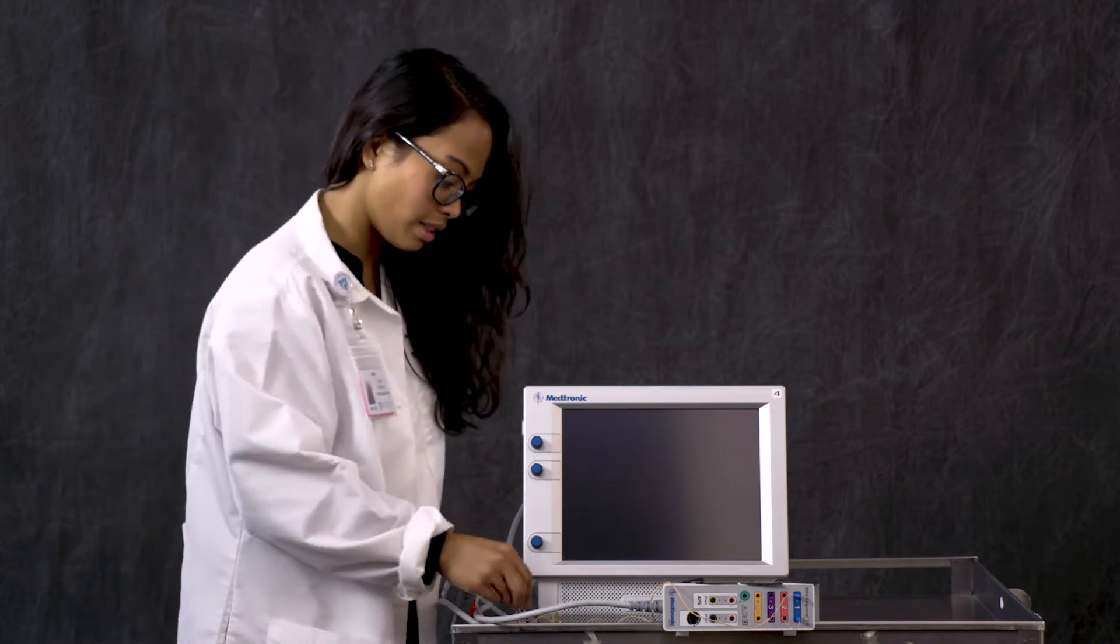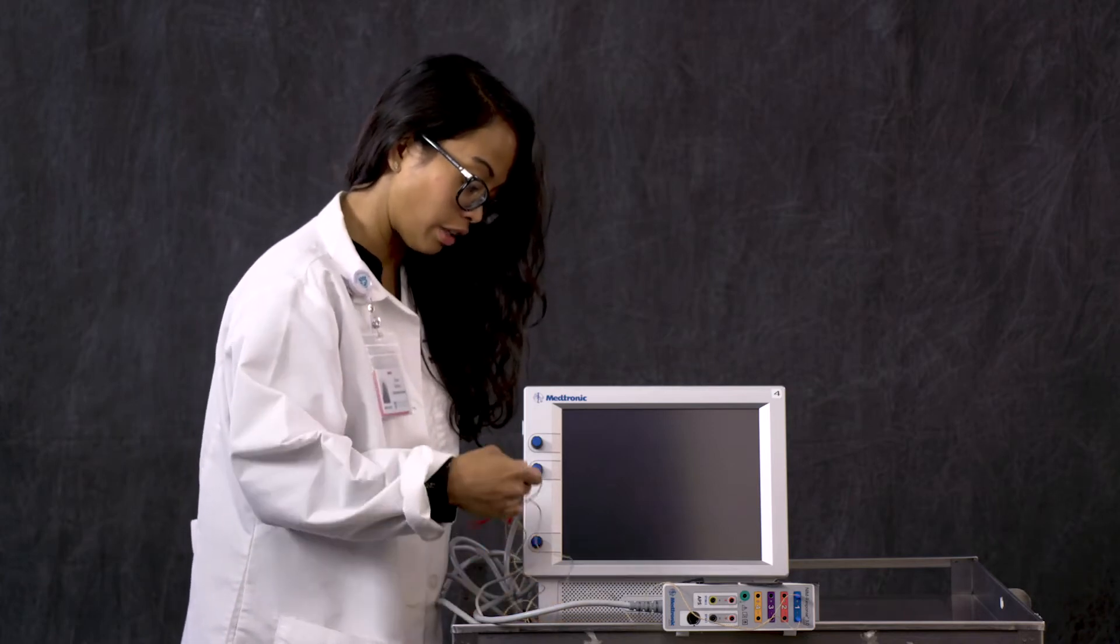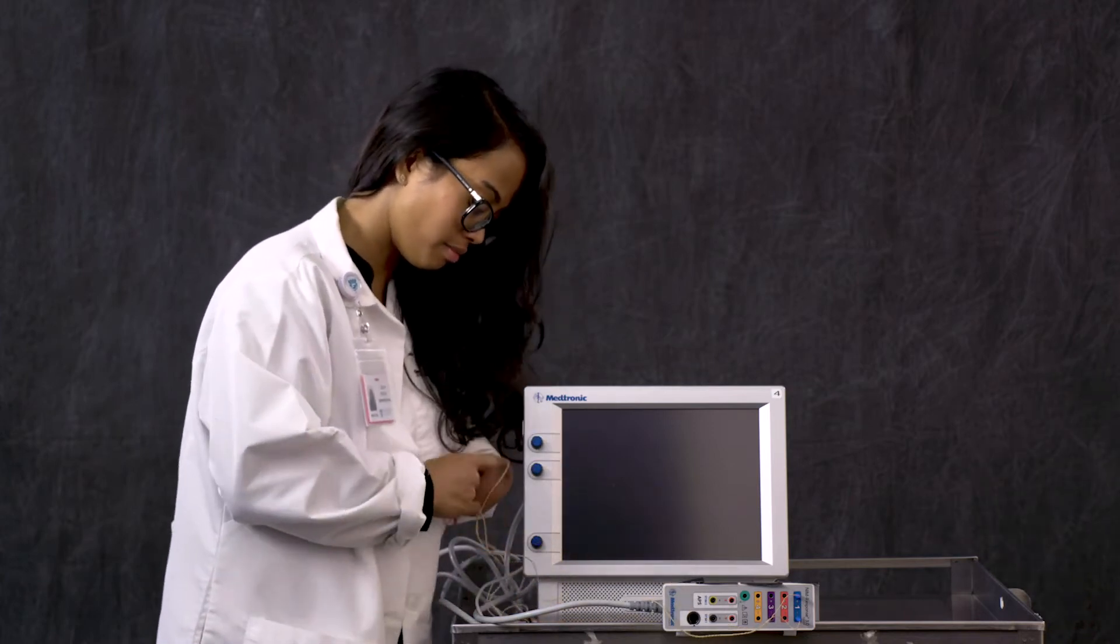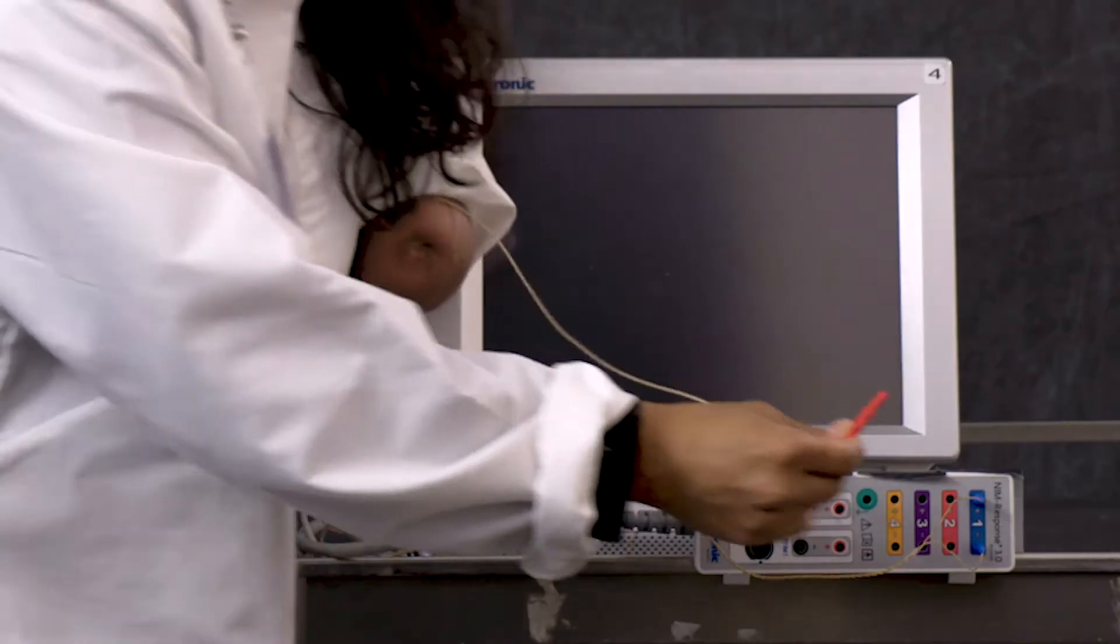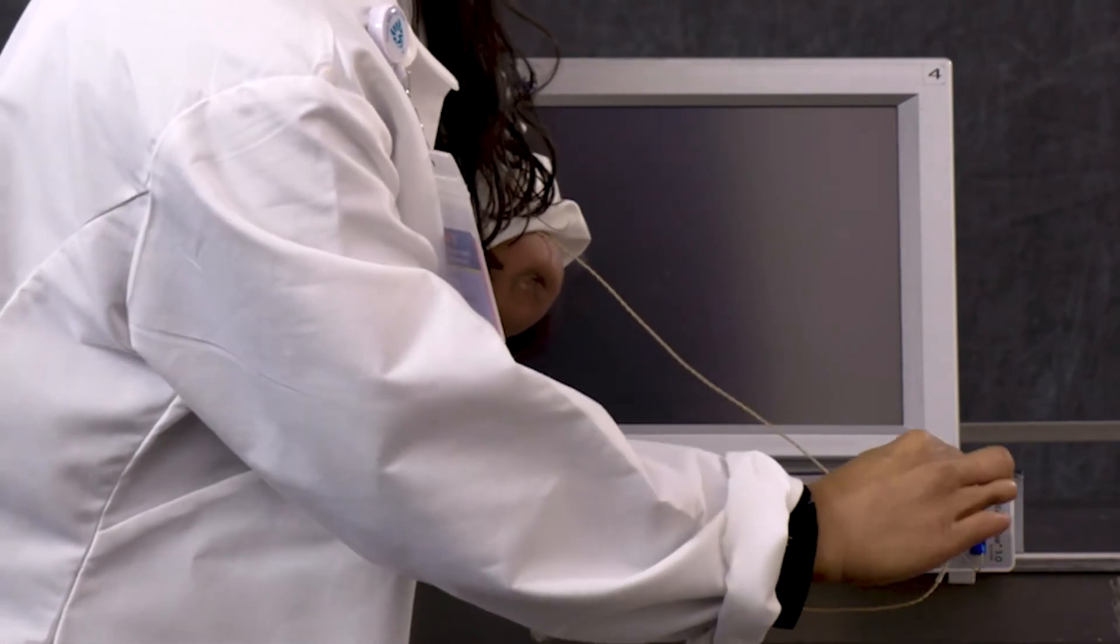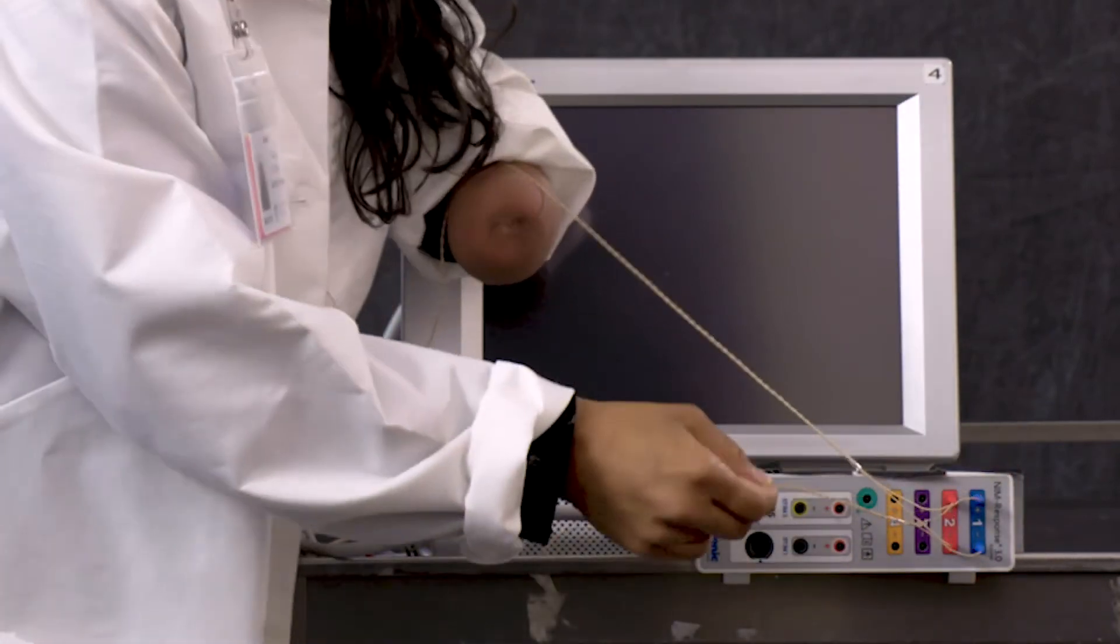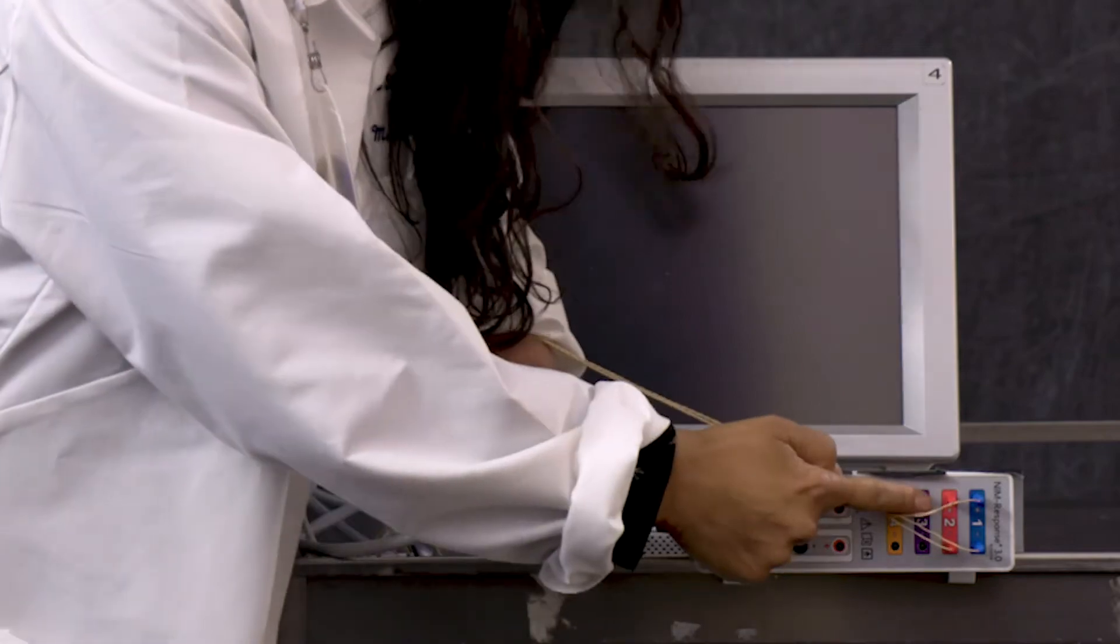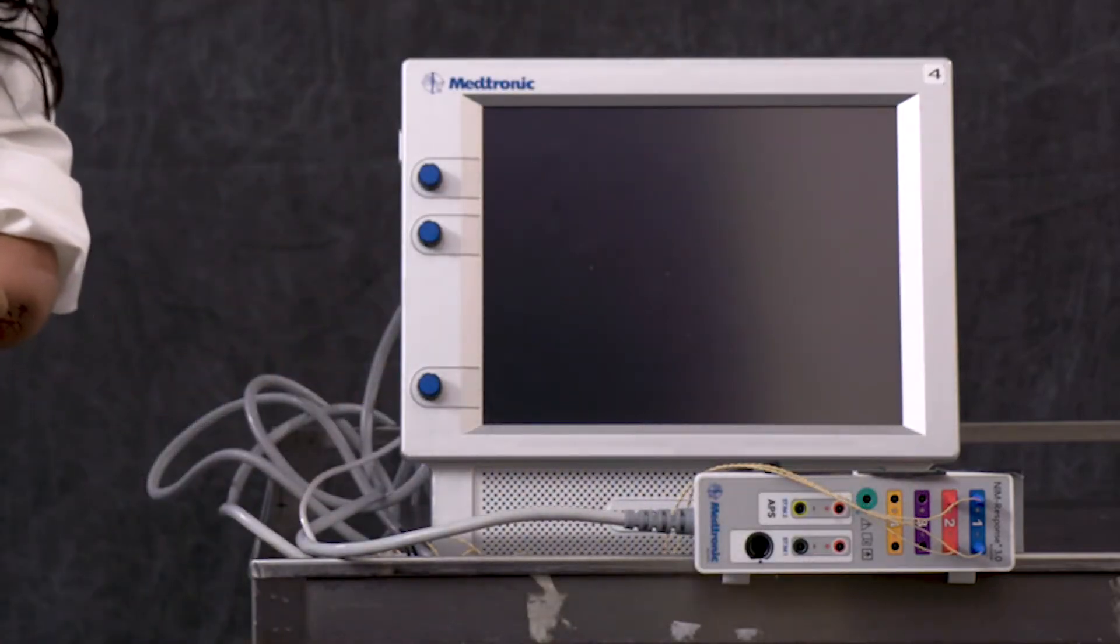The next electrodes that we're going to place are color-coded red, and this is for our hyostyloglossus channel or the exclusion branches or muscle branches of the hypoglossal nerve. These are going into the second channel. The electrodes we are placing towards the back of the tongue superficial to the mucosa.